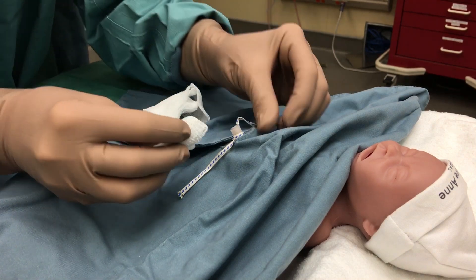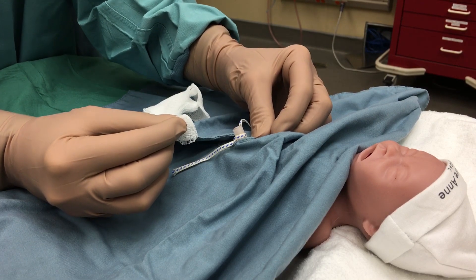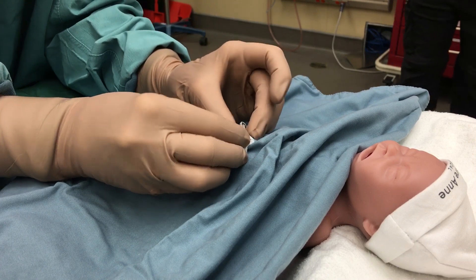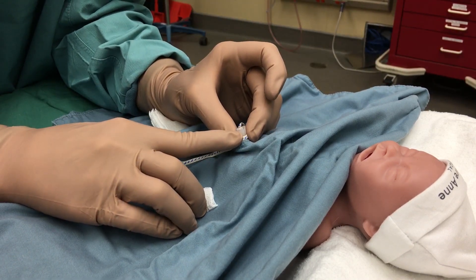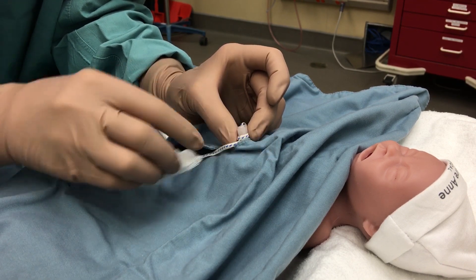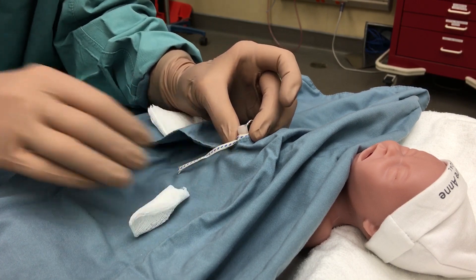Now that we have cut the cord, we may see some bleeding, and we need to visualize the vessels. Very often there will be the very thin-walled and bigger vessel, which is the UVC, often at the 12 o'clock position, and our two artery vessels, which are tinier and more thick-walled.